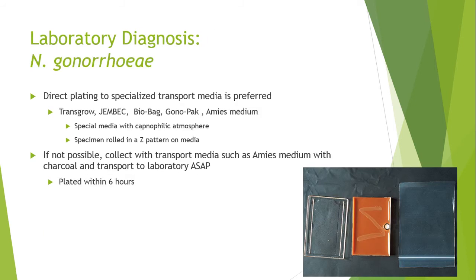So these are the different types of media that we might inoculate. And these are transport media. So Transgrow or JEMBEC is a big one. Basically the nurse or physician inoculates the transport media right after collection. Remember, it's a fastidious organism. They're sensitive, so we've got to inoculate the transport media right after we collect it.